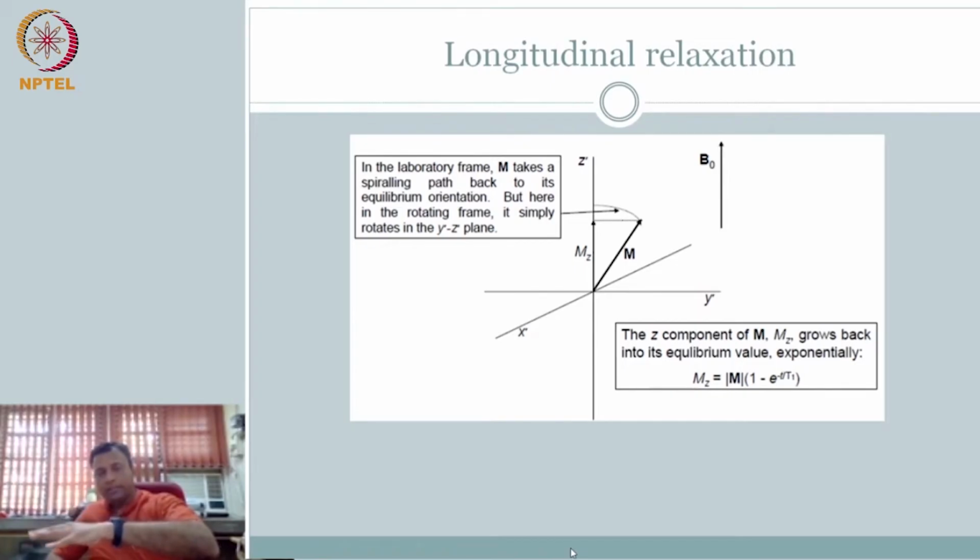No, there are two relaxation times involved. So the decay in the free induction decay that you saw, right? It started with a maximum value, and then with the time it decays. Initially it decays faster due to the T2 star effect, and then it continues to dephase due to T2 effect, and then eventually the signal goes to zero. On the other hand, the MZ component increases. So your T1, which we called the T1 relaxation time. Okay. So now the question is, I can play this game every time.